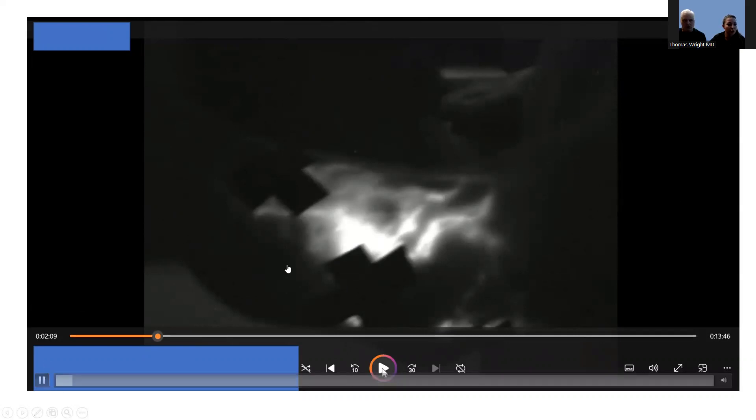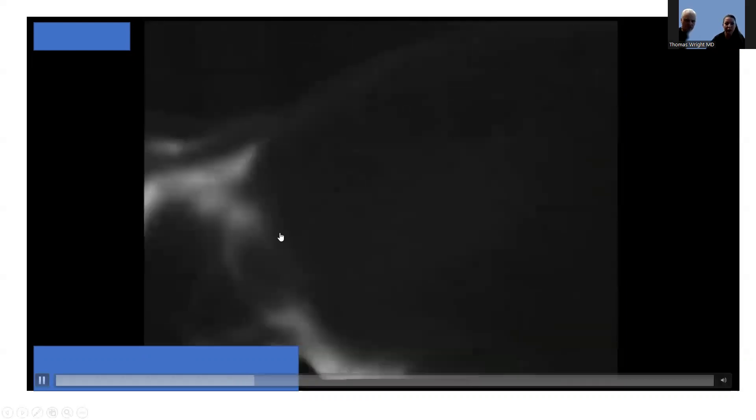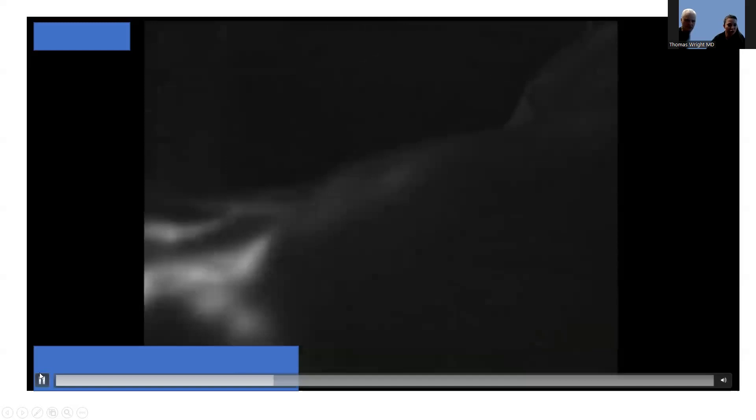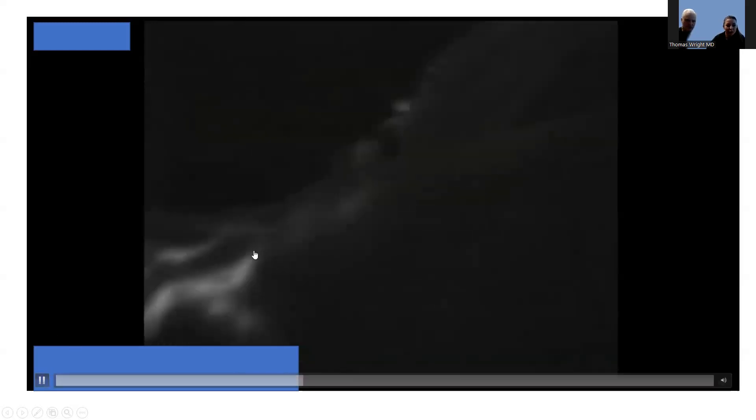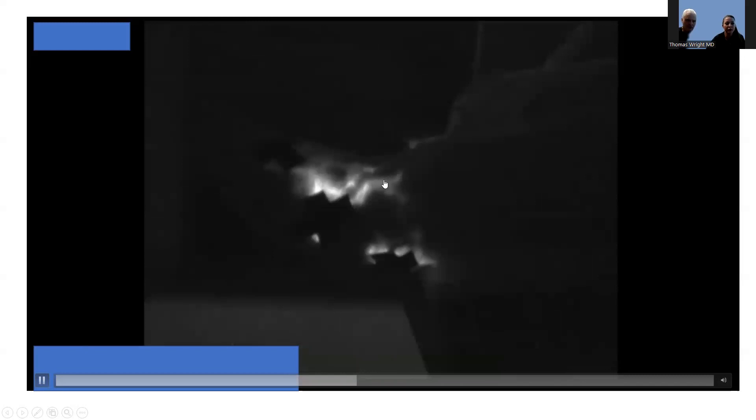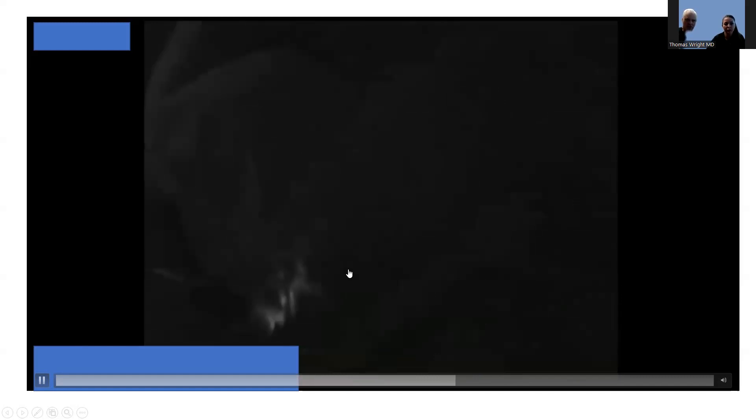So this is that same patient, but this is that lateral image, that outside part of her leg. The lateral is like four different lymphatic channels, the main lymphatic channels. And so the outer leg is a separate lymphatic channel. This one here, I kind of went up that leg and back down. You can see that cuff here. I'm a little shaky right here, I'm just going to balance out here. I really wanted to get an image of that calf from far away and you can see very clearly that is the top of her foot, those three X's and that cuffing right there. And there's no visible flow above that cuff of that indocyanine green. Wow, striking. That's really, you can really see where the lipedema tissue starts and ends right at that cuff.